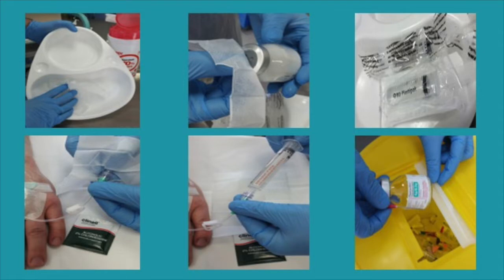Now I'm going to show you an example of an IV. So I'm in my treatment room. And I want to get all of my equipment together, so I'm going to be touching all of the door handles, the cupboards, etc.